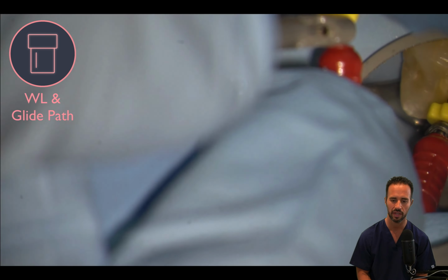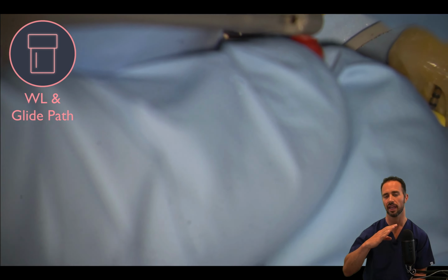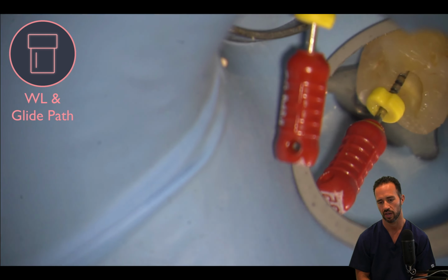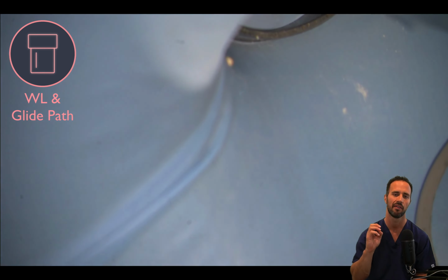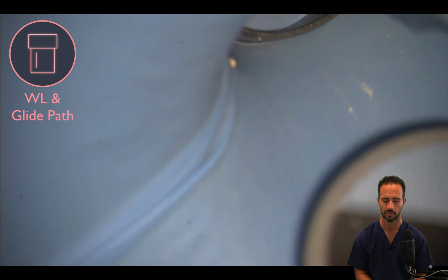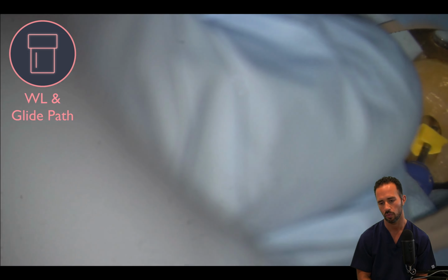So even my 25 hand file in red here is still very loose, and it's causing my apex locator to jump quite a bit. And so we're going to keep going up until we have a tight fit. And there we go. There's our 30 hand file all the way down.